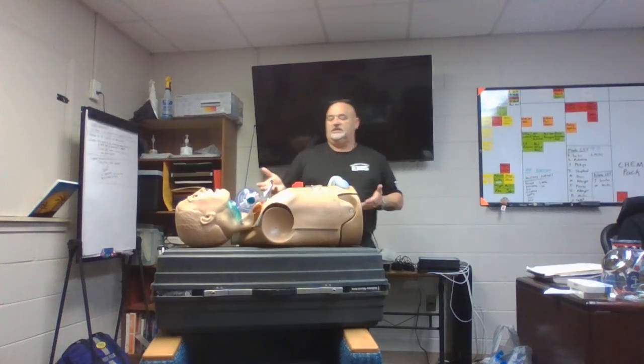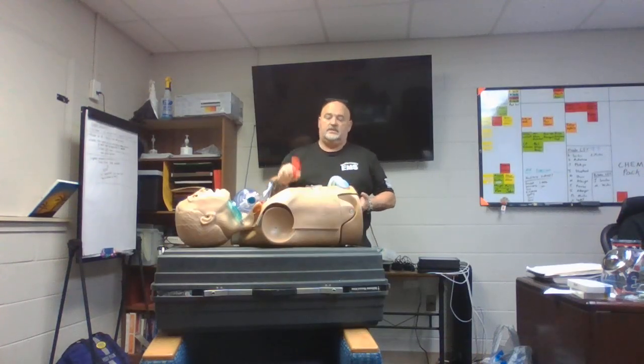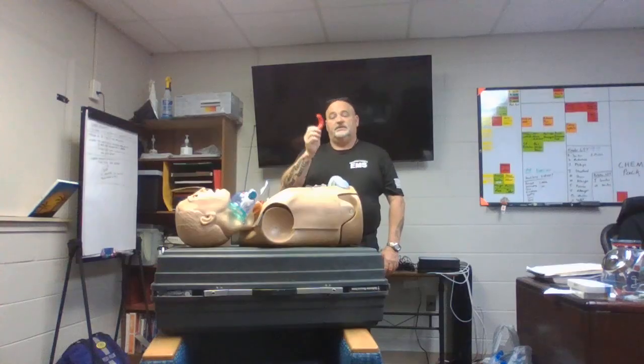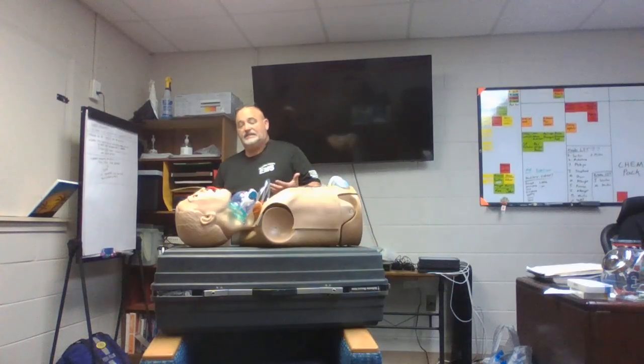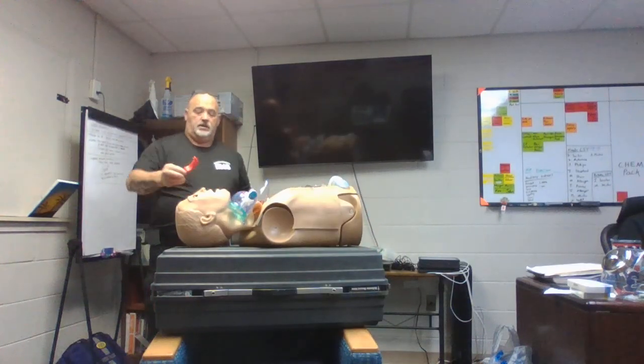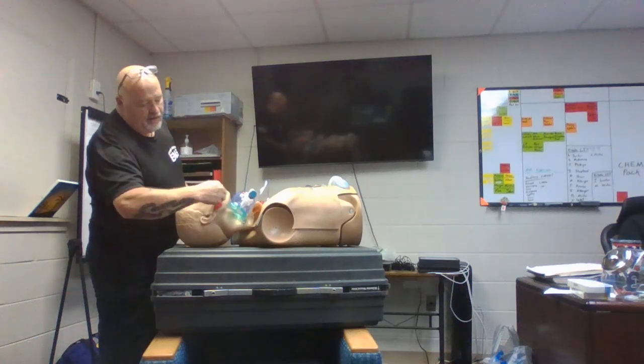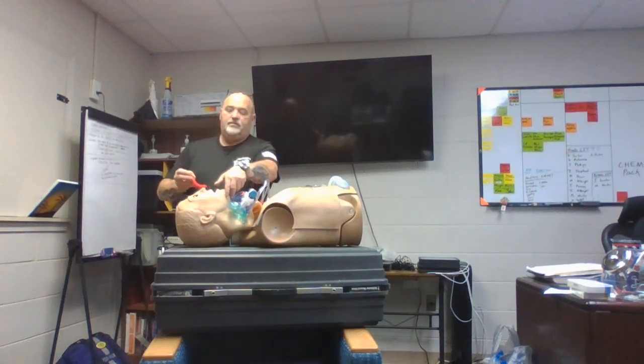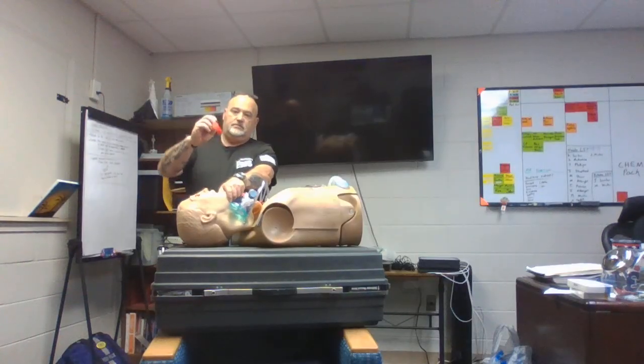If we're not, we're going to switch to an adjunct. Do they have a gag? Yes. We're going to switch to the NPA then. If they don't have a gag, and they've not ingested any caustic substances, we're going to select the right size, right? We're going to say, man, that looks about right there. Remember, you can put this in.